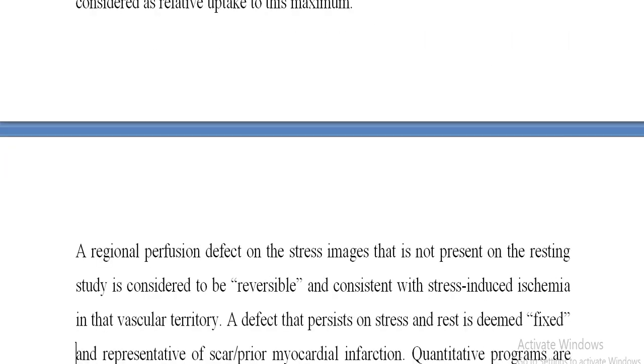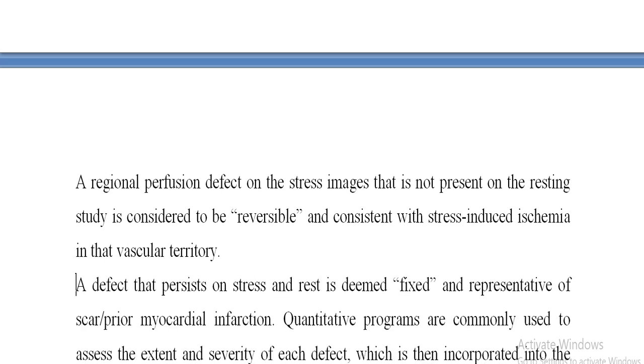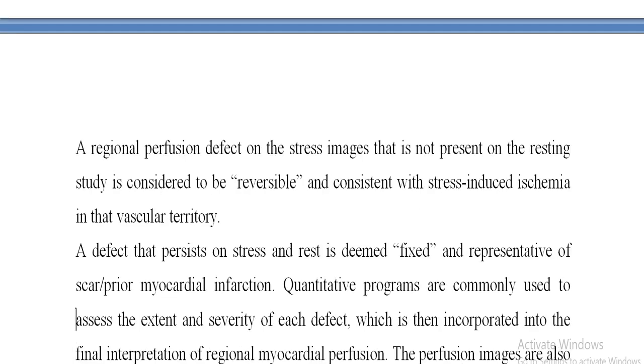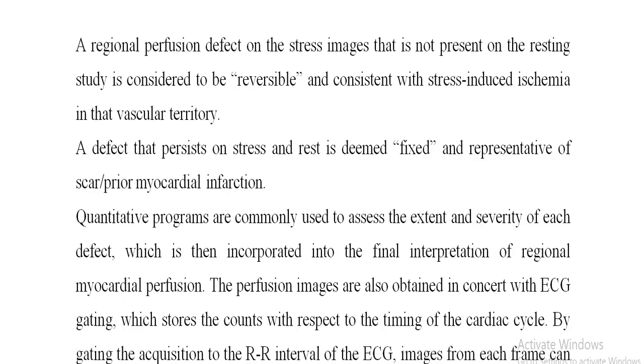A defect that persists on stress and rest is deemed fixed and representative of scar from prior myocardial infarction. Quantitative programs are commonly used to assess the extent and severity of each defect, which is then incorporated into the final interpretation of regional myocardial perfusion.